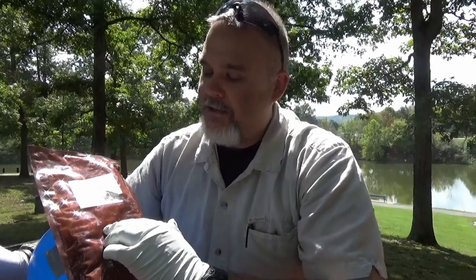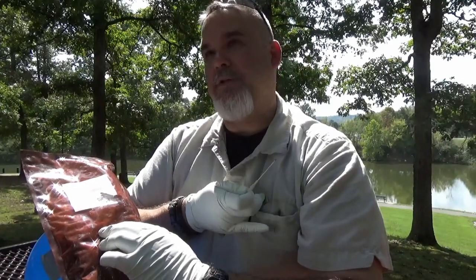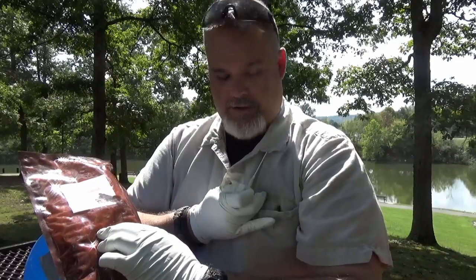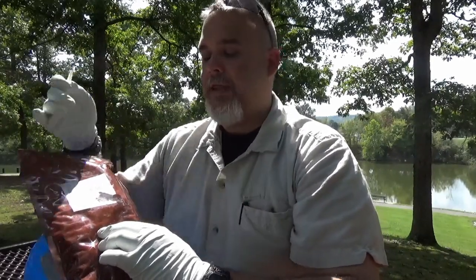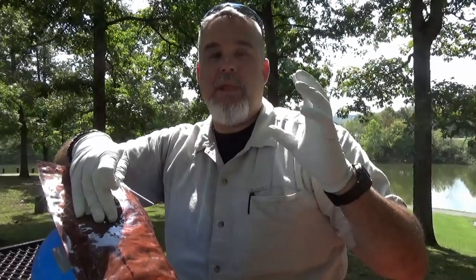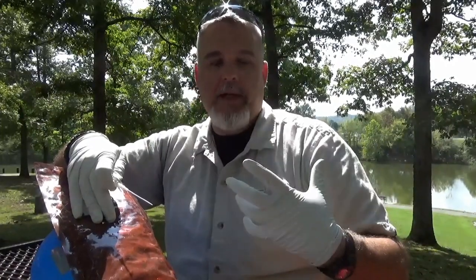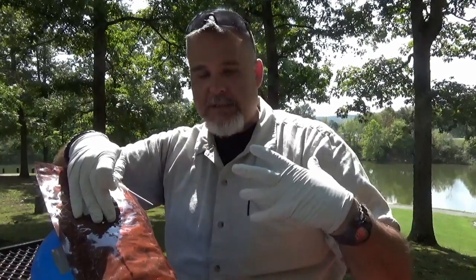When you palpate your site, you've got two different sites you can use. You've got the second intercostal space, mid-clavicular line — which is about right here — and then you've also got the fifth or sixth intercostal space on the mid-axillary line. Depending upon your environment and situation will determine which site you're going to use. If you're in a warm zone that can go hot at any minute, you want to go to the mid-axillary site. If you're dealing with an officer, the reason to go there is to leave their body armor on — if you can leave the officer's body armor on, you're going to be in a lot better shape.